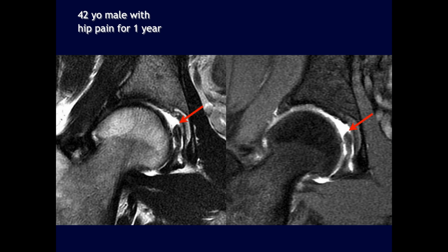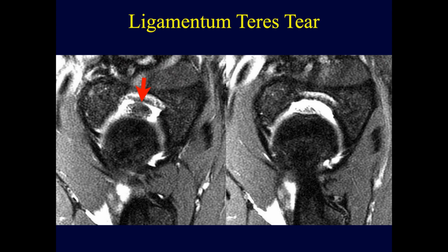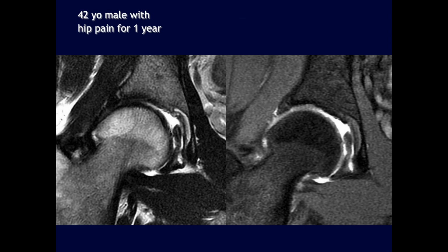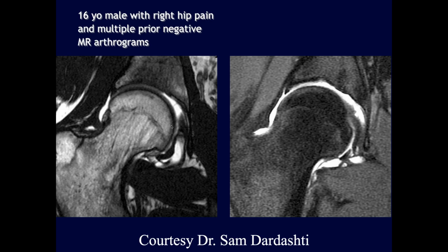And does the labrum look normal to you, John? Yeah, so that's the previous one. That's the other case. So the ligamentum teres also looks kind of thick and irregular, but I think it's intact.